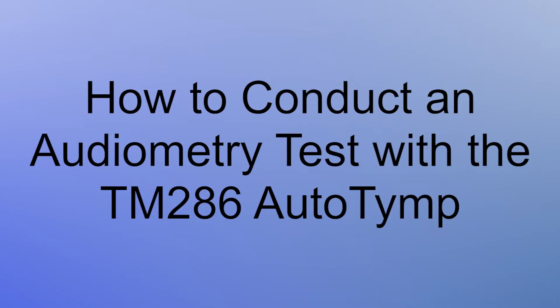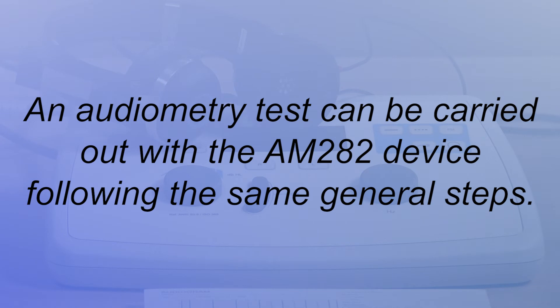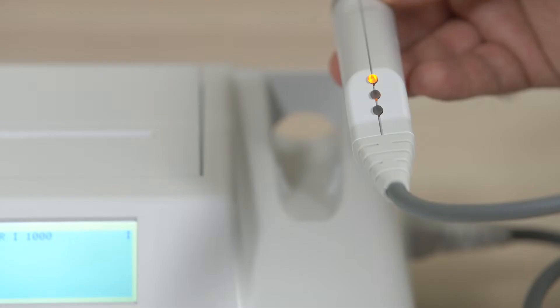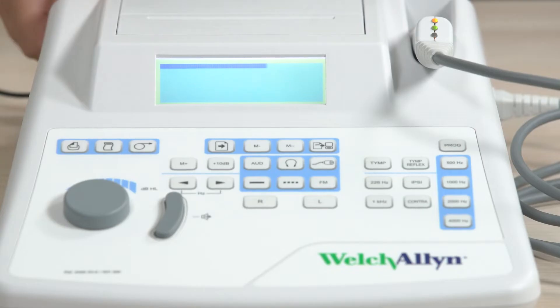Now we'll review how to conduct an audiometry test with the TM286 device. An audiometry test can also be carried out with the AM282 device following the same general steps and using the same buttons and knobs. Turn on your device. When power is turned on, the LCD will be illuminated and the orange light on the probe will be lit. The display will show a scroll bar across the top to indicate the system is initializing. Allow the instrument 10 minutes to warm up.